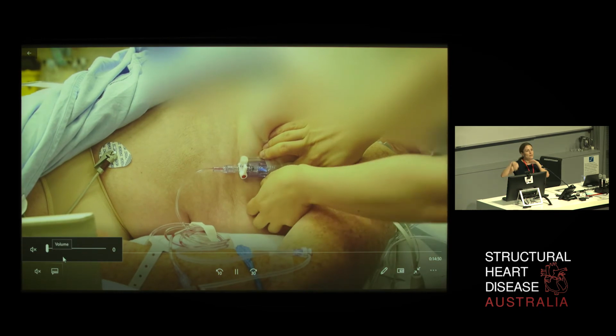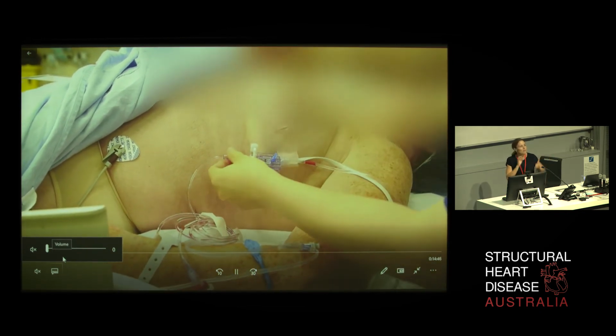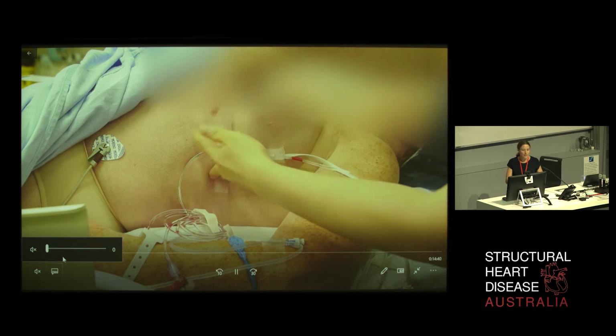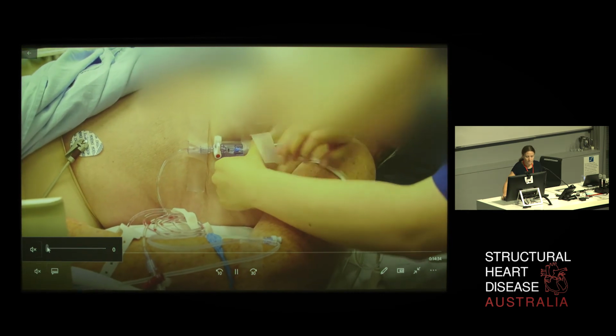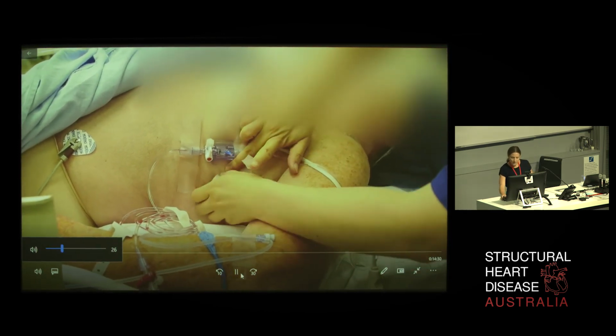So this is fourth intercostal space down the rib cage, halfway between the AP plane. Very, very important to put that in the correct position because that changes all of the values with the right heart cath. And we attach it to the patient, but you don't necessarily have to. I've worked at Vinnie's where you don't. I might try and fast forward this too.